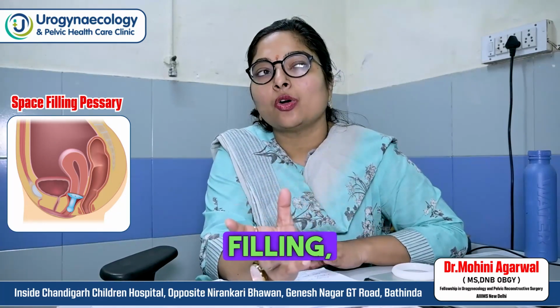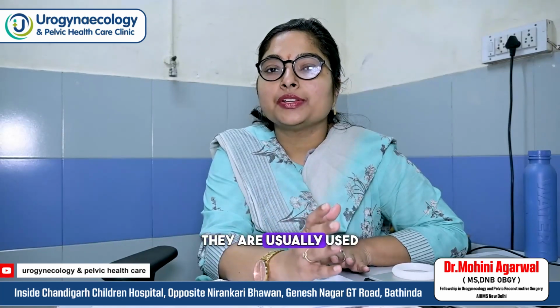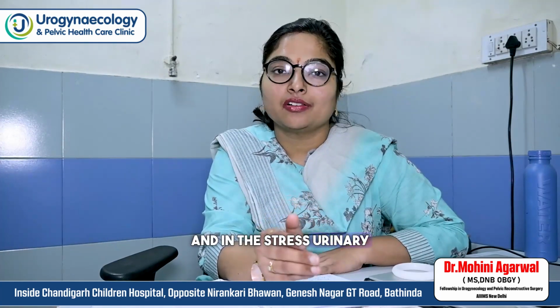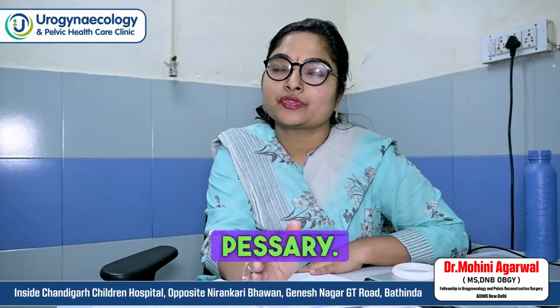Now, what are the commonly used space filling pessaries? Gellhorn, donut, and cube pessaries. These are the more commonly used space filling pessaries. Now, ring pessaries are usually used in stage 1 and 2 prolapse. They can be used for higher grades, but are usually effective in first and second stages of prolapse and in stress urinary incontinence, ring with knob. For the more advanced type of prolapse, you use the space filling pessary.